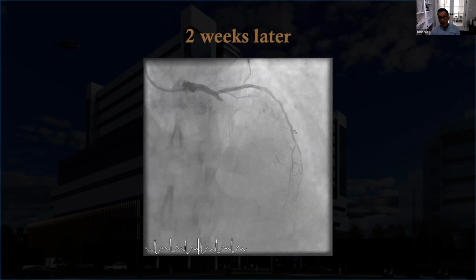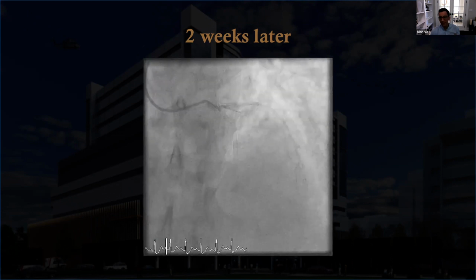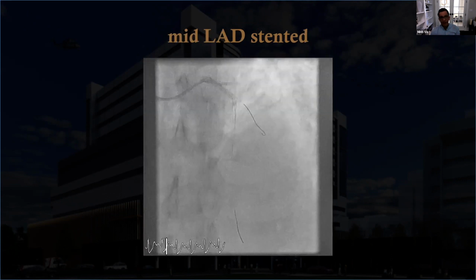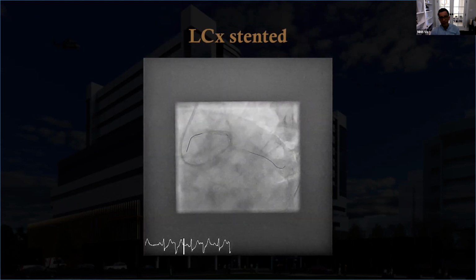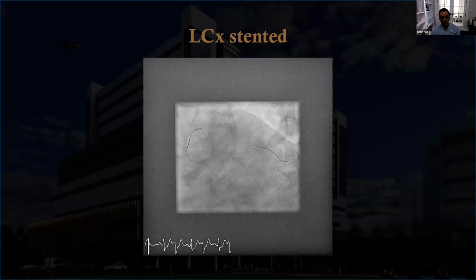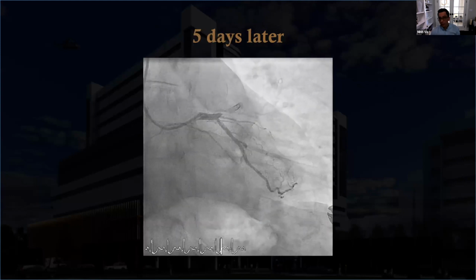He came back 2 weeks later with stent thrombosis. We all thought, nothing to do with COVID. It's just the patient. He's stent thrombosing. He did miss 1 day of Plavix, ticagrelor. So maybe that's the reason. So that was treated with 1 stent by a colleague. Again, no coronary physiology. He decided to treat the ostial left circumflex, whether rightly or wrongly. Again, no coronary physiology. Looked kind of severe. So when he treated those, 5 days later, stent thrombosis of both stents.